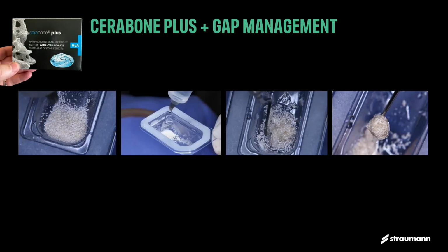We proceed to the gap management. Remember, those are extracted sites. There will be a gap between the implant and the buccal wall.